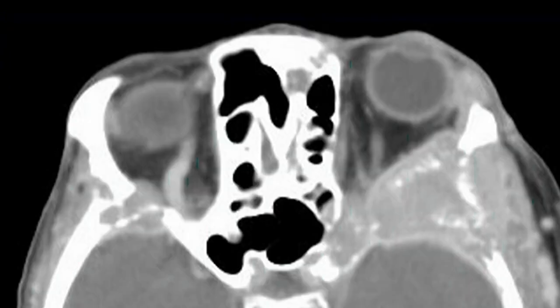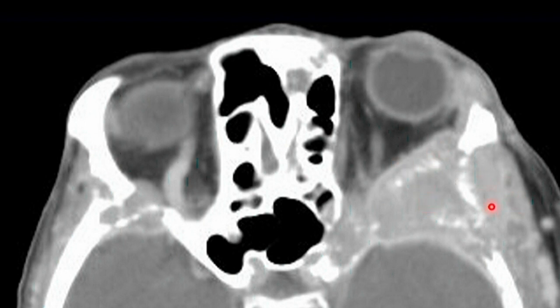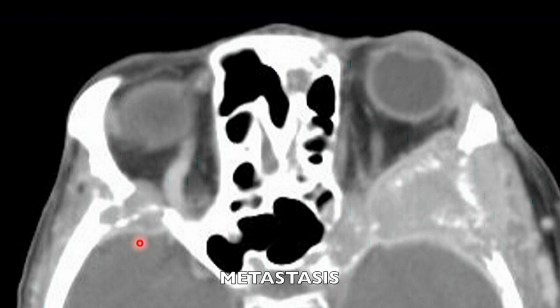This is a huge lesion centered not within the orbit itself, but within the triangle of bone behind the orbit — the sphenoid buttress. This is a bone lesion secondarily involving the orbit, temporalis fossa, and middle cranial fossa, expanding in all directions. If you look carefully, you'll see a somewhat smaller counterpart on the other side. This is metastatic disease — in this case breast cancer — but metastatic disease from any source to bone could produce this appearance.